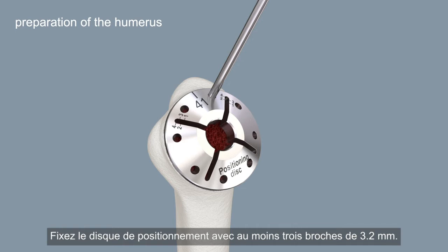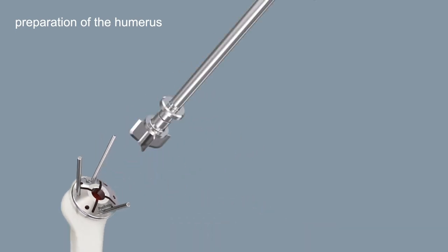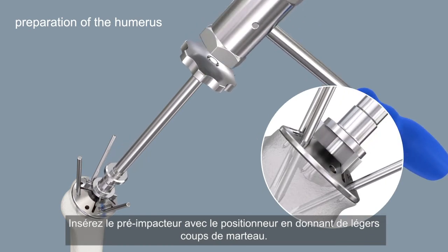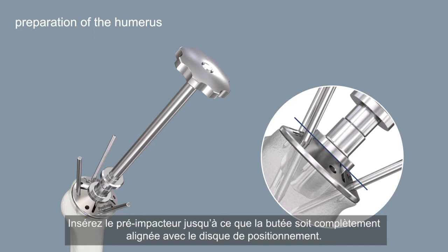Fix the positioning disc with at least three 3.2 millimeter pins. Insert the pre-impactor using the positioner with gentle hammer strokes. It is mandatory to hold the positioner orthogonally to the resection plane. Insert the pre-impactor until the stopper is completely flush with the positioning disc.